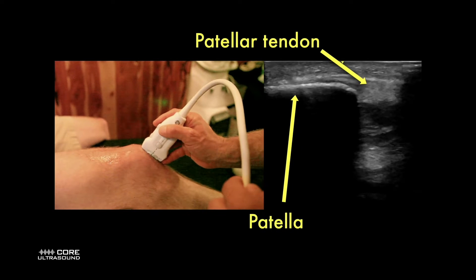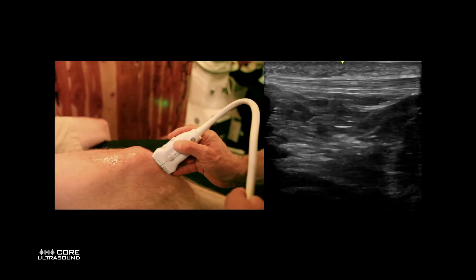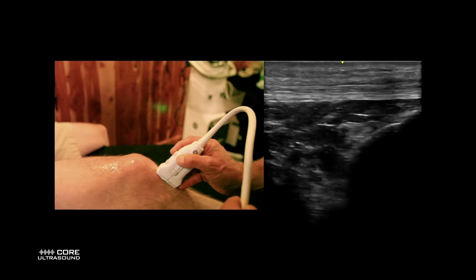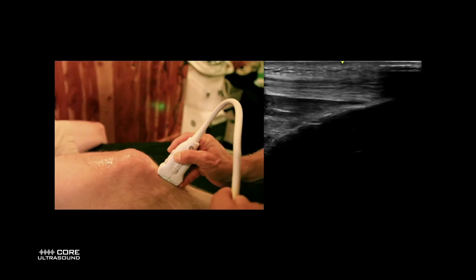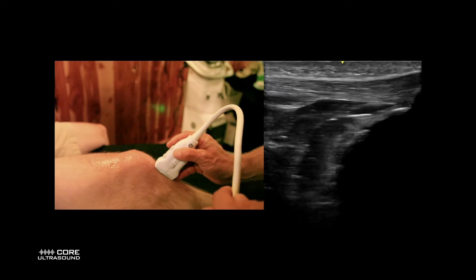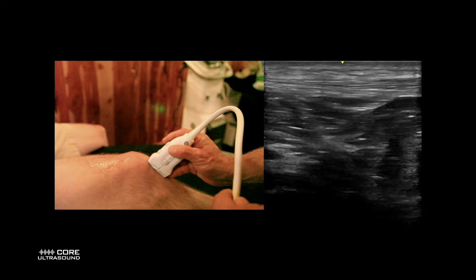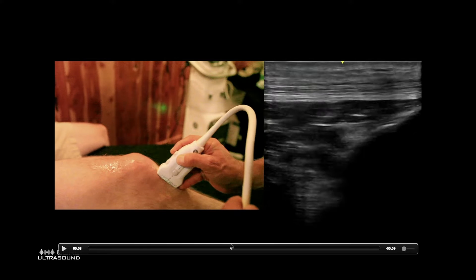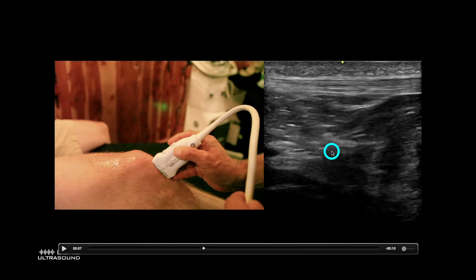You can also look in the infrapatellar area. We have the patella on the left side of the ultrasound screen with the patellar tendon on top. Deep to that, we are going to see the tibia, and then just superior to the tibia — between the femur and the tibia — we're actually going to see a bit of a fat pad. This is called Hoffa's fat pad, and right here we're probably seeing a bit of cartilage on the femur.